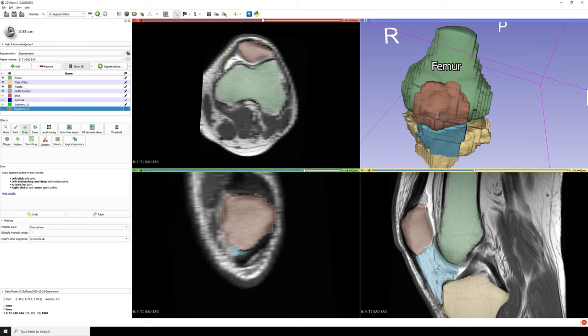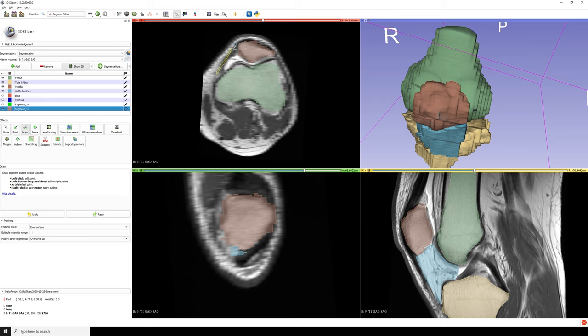So here we have the femur, the tibia, the Hoffa's fat pad, and the patella, which is the kneecap. Cartilage is not shown here, so the spacing in reality is actually a little bit smaller than what it looks like on this model.